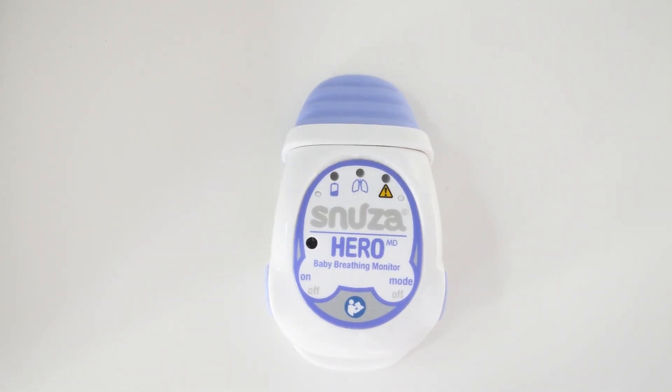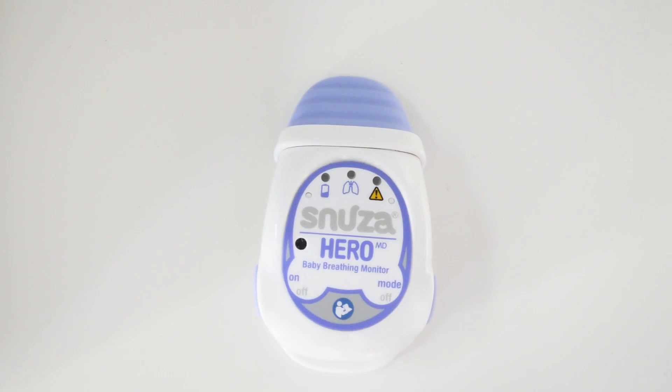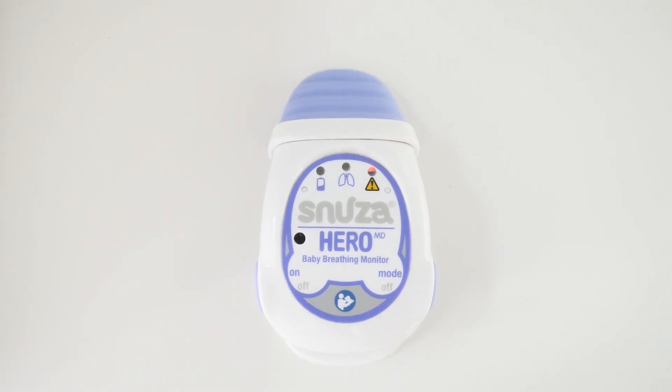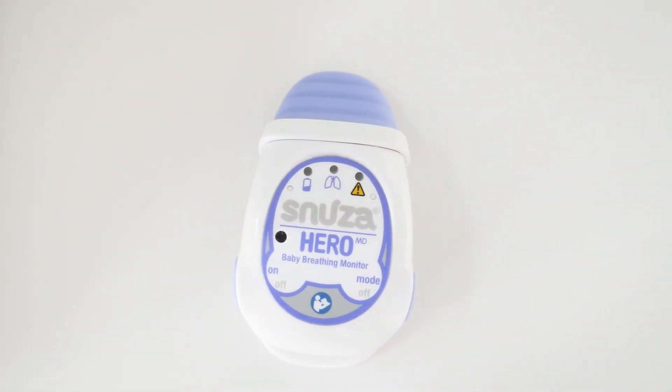I'm just going to show you how to turn the monitor on. It has to be on a hard, flat surface. You just press this button on the side here — it does a self-test and it's ready to go. We'll just leave it there for a few seconds and then you can see how the alarm sounds. Usually the light on the lungs would flash to detect movement. To turn the unit off, press on both sides and then it's finished. So that's the alarm it makes — it continues to vibrate even when it's making the really strong alarm.